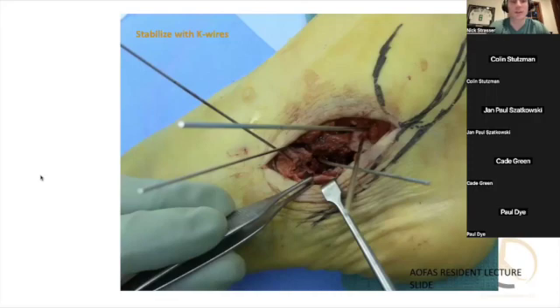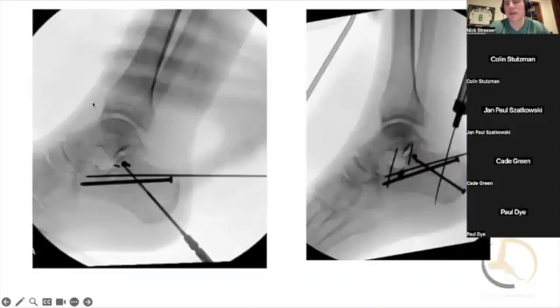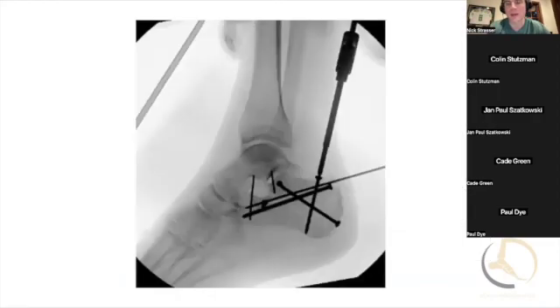Here we have some provisional K-wires placed there, holding those pieces together and holding the reduction. You can see now the critical angle of Gissane has been restored. You have a pretty good view of the articular surface. You can actually see here the undersurface of the talus right here, and you're trying to match that articular surface from that lateral facet. On this case I used screws — a 4.0 screw from posterior to anterior, and then a 3.5 or 2.7 screw from lateral to medial. And oftentimes I'll use a screw from superior to plantar to hold that piece down as well.